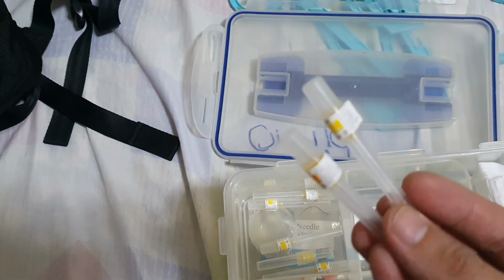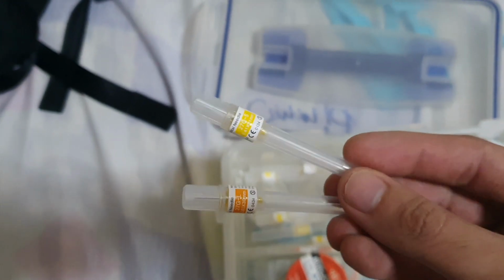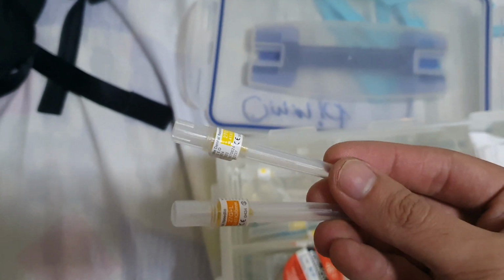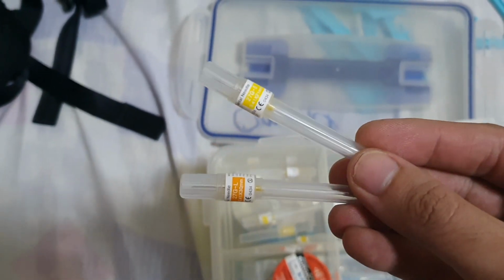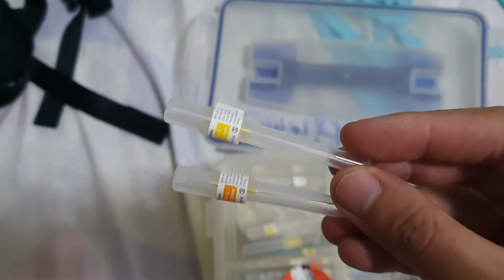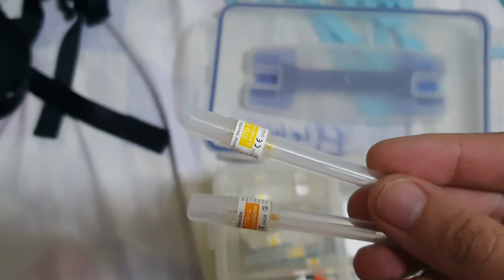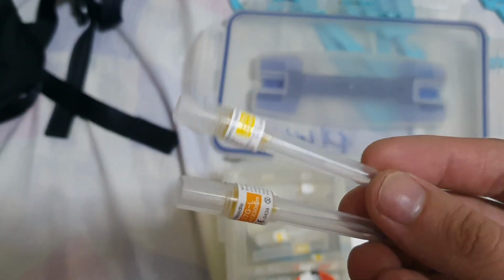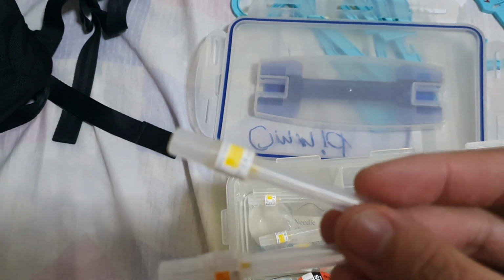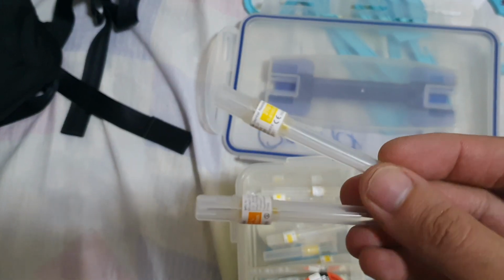If you're going to give anesthesia, the short needle is good for the anterior portion of the mouth. If you're going to do the ASAN technique, ASAN block, ASAN means anterior block. ASAN is in between the canine and the first lateral incisor, where you're going to inject. And it's okay for the MSAN also, middle injection. You can use the short needle for the MSAN and the ASAN.